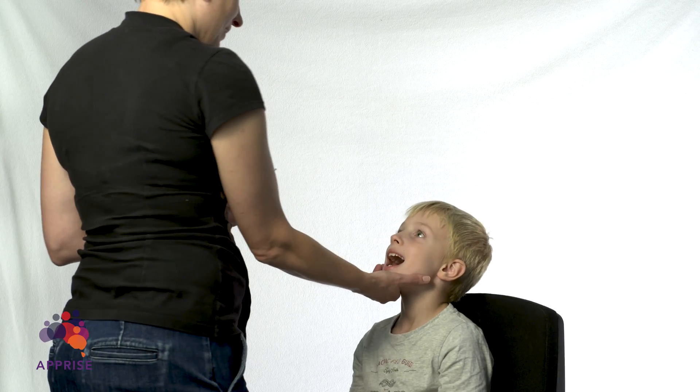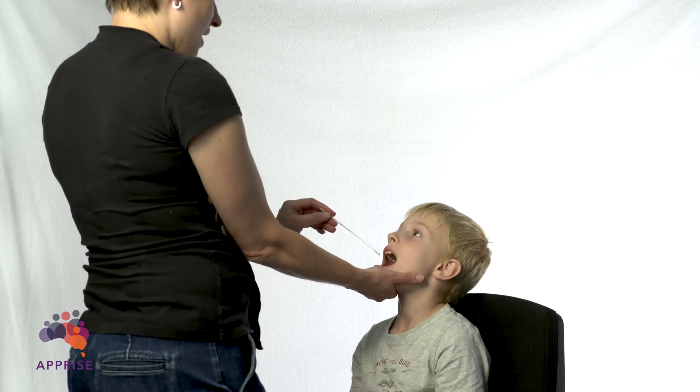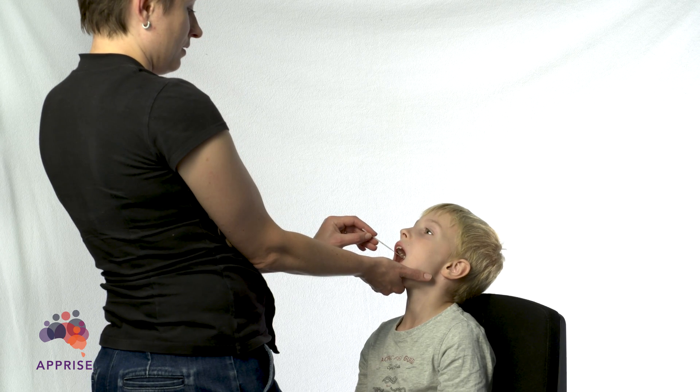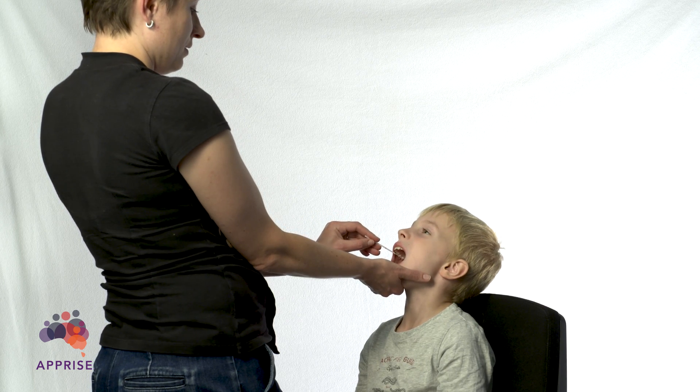Sitting down, tilt your child's head back. Ask your child to open their mouth and say ah. Try to keep your child's mouth open as much as possible.